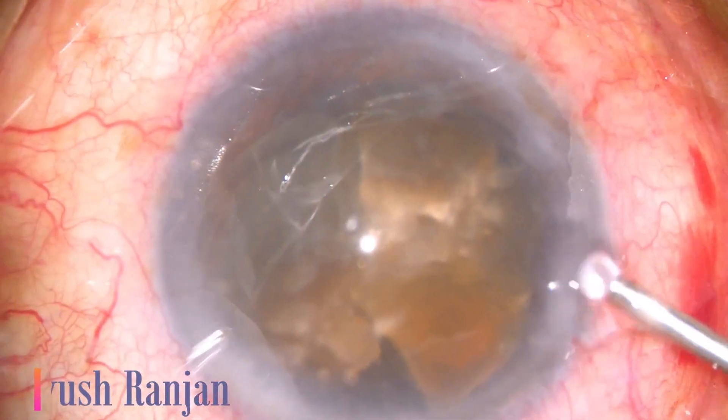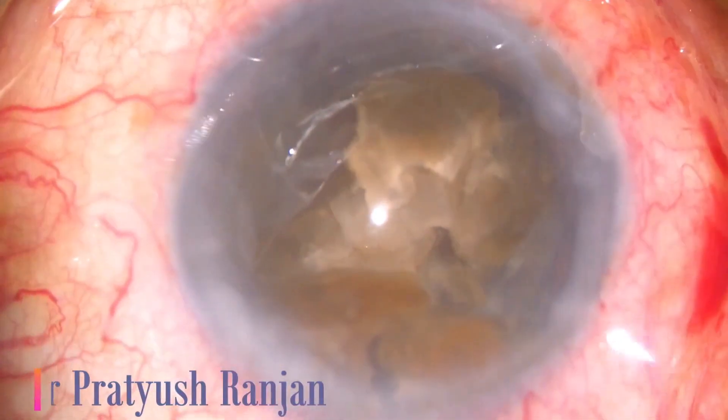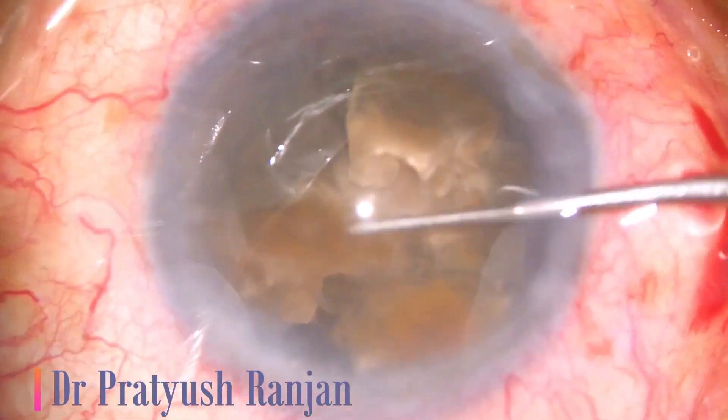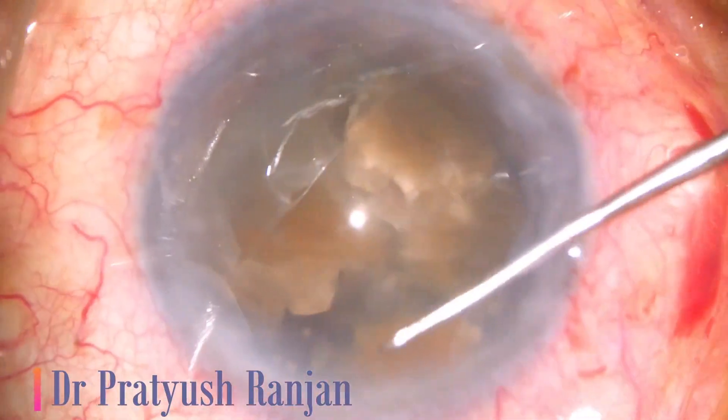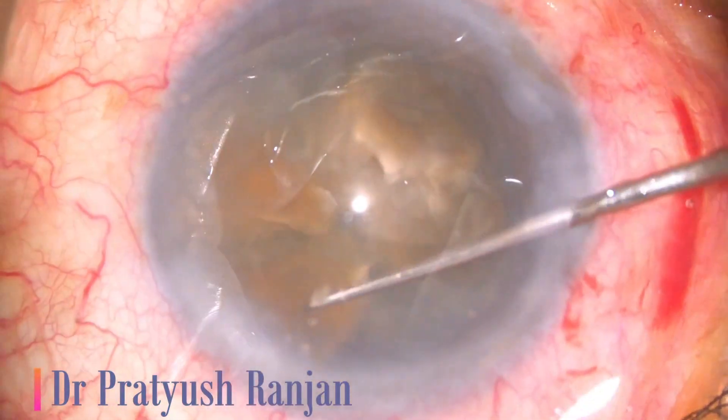Once all the nucleus is sculpted, OVD is injected to push nuclear pieces back to the capsular bag, and then you emulsify in the bag. That makes nucleus management very easy, especially in hard cataracts. This one is also a brown leathery cataract, very well managed by the cartwheel chop.